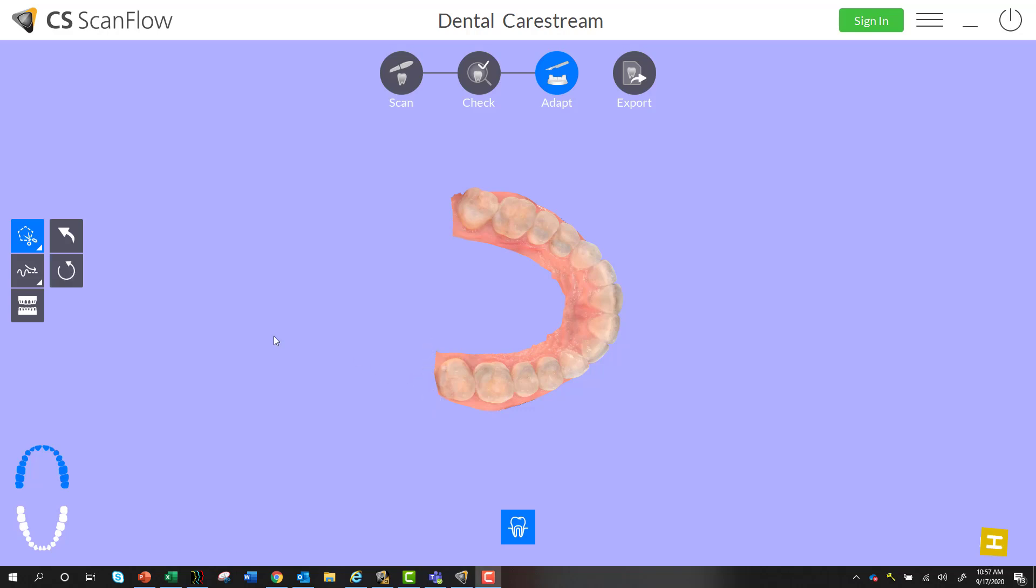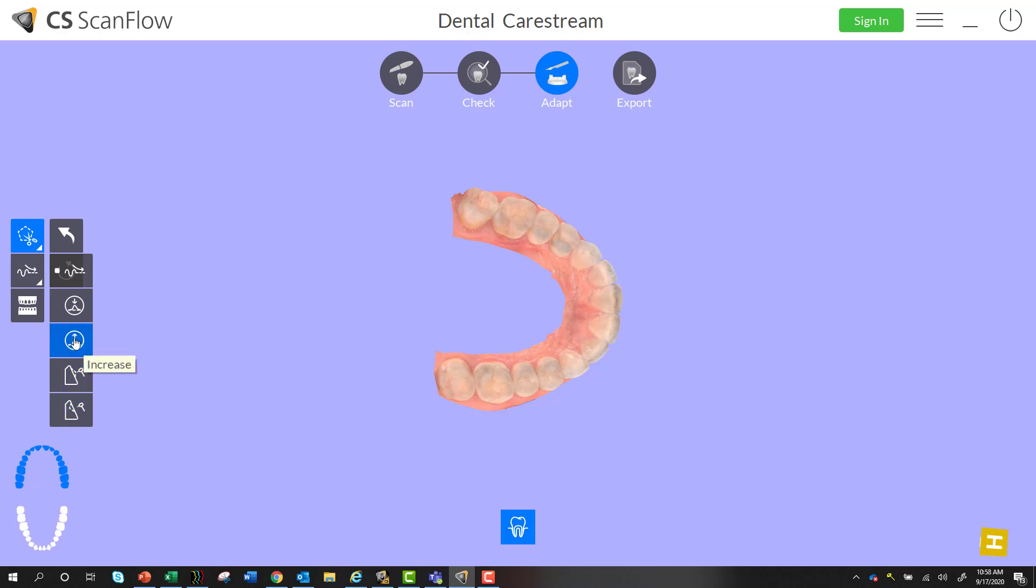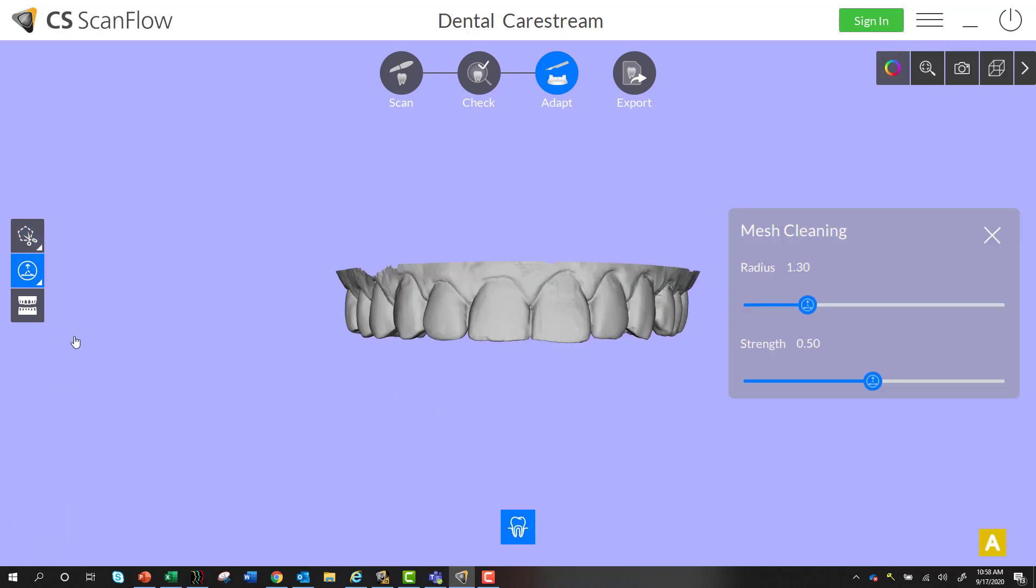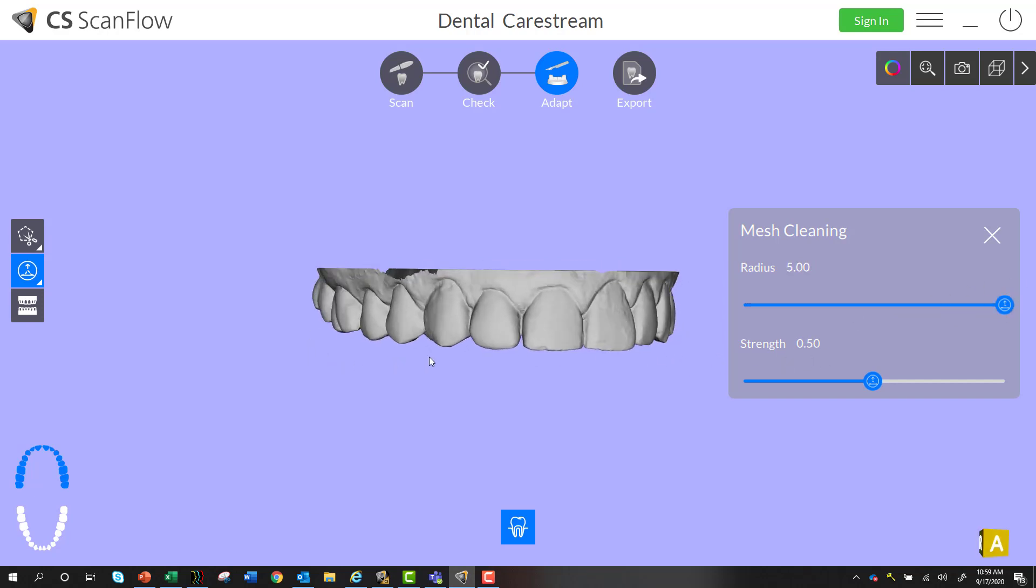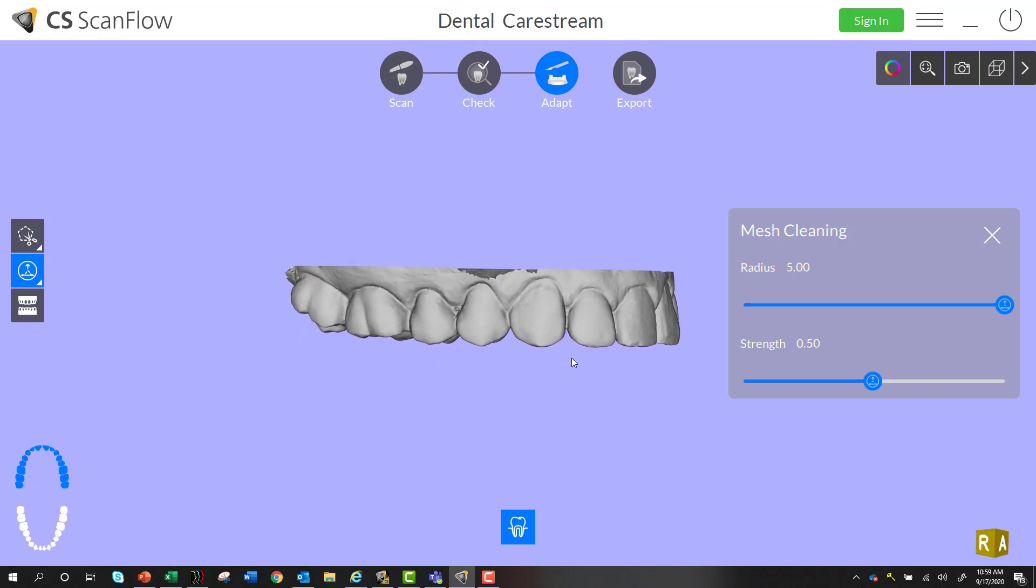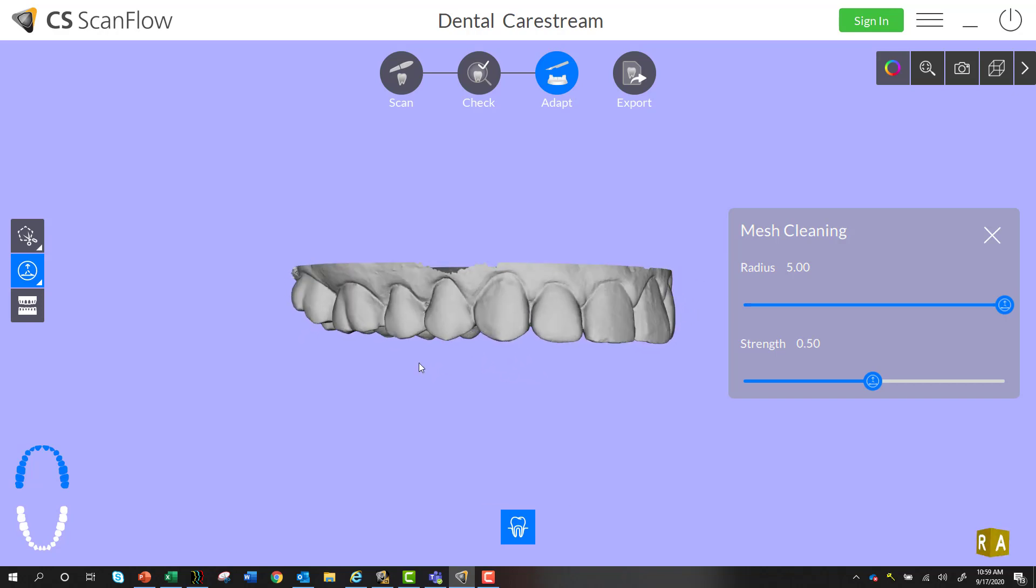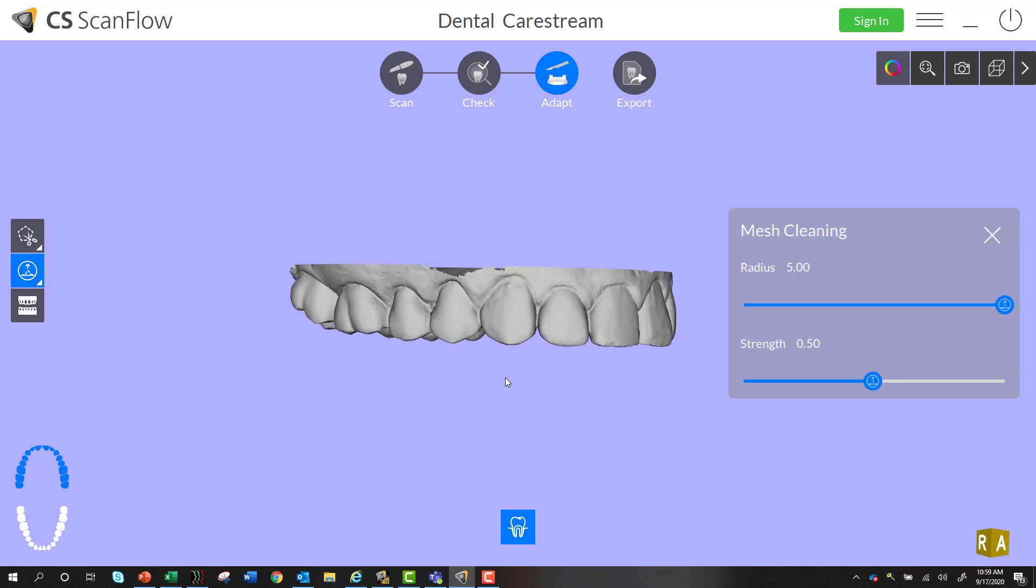So next we're going to go into our adapt tools over here and you can see there's a few different options: decrease, increase, uncarve, or carve. For this we're going to use this increase feature. You can increase the radius to five and leave the strength at point five. You can try different variations of course, this one seemed to work for me.